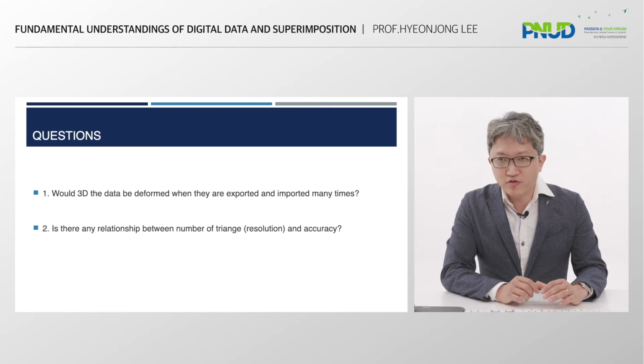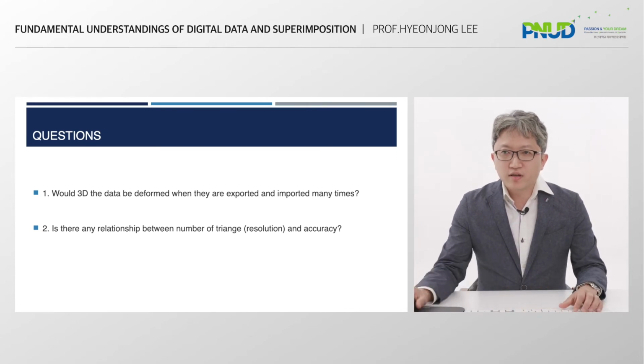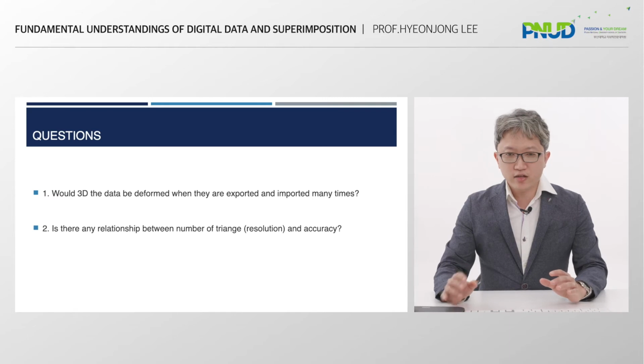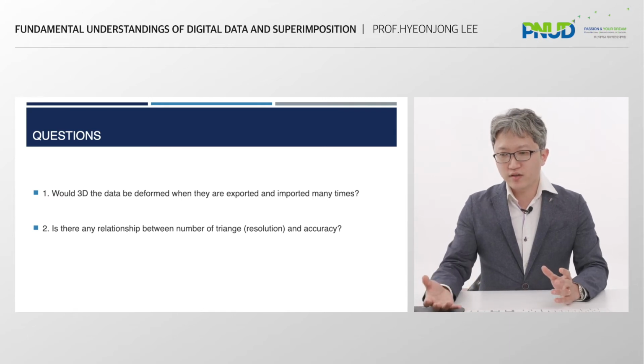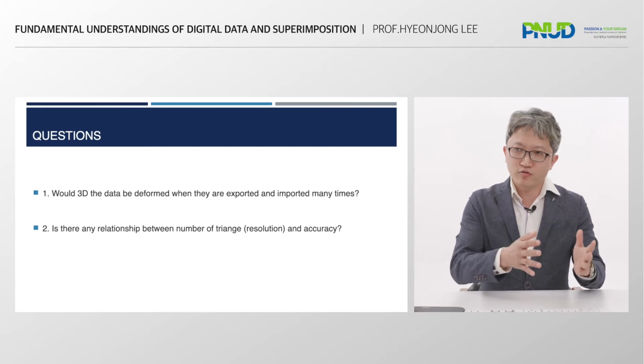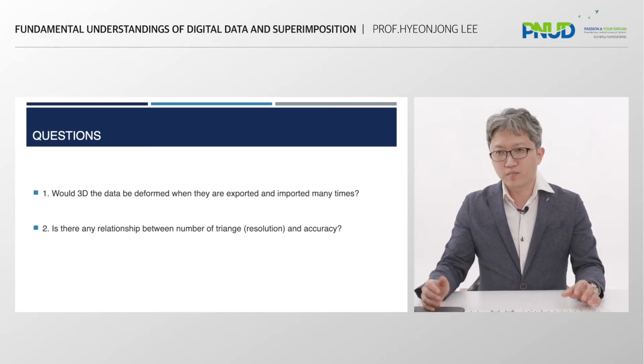Let me give you two questions. Would 3D data be deformed when they are exported or imported many times? So it means when we handle 3D data, a 3D STL file, we can export from one software and then import to another software for many purposes.